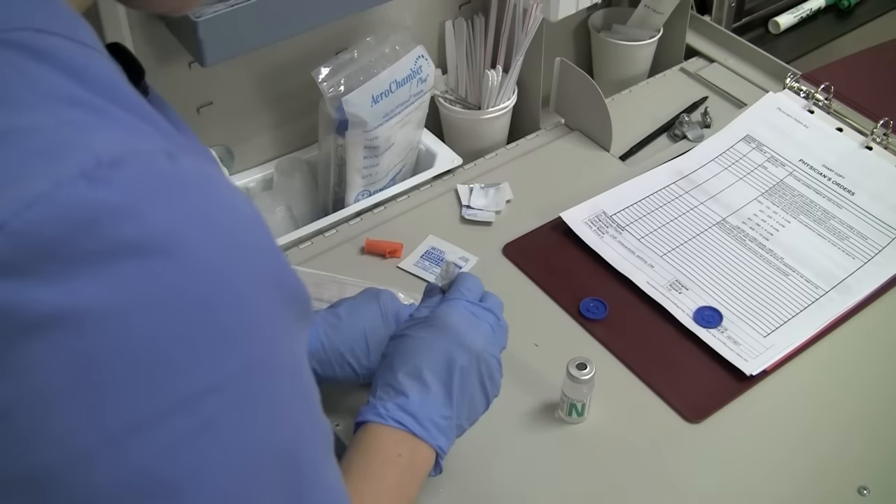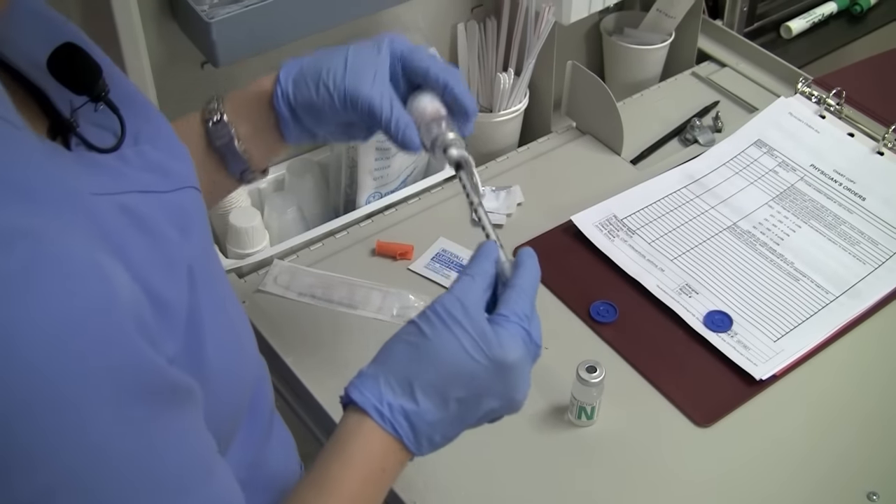Inject 10 units of air into the regular insulin vial and promptly withdraw 10 units of regular insulin.